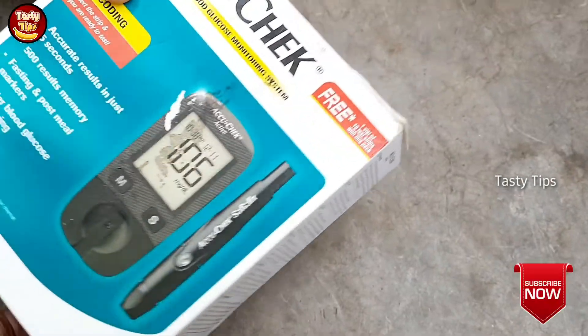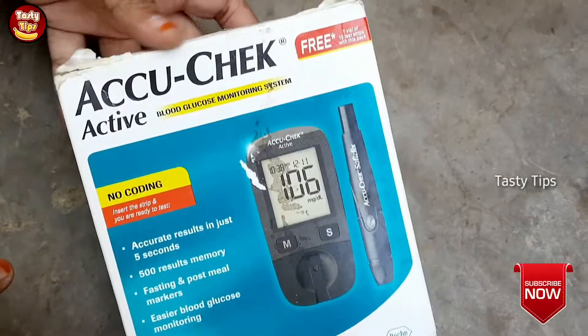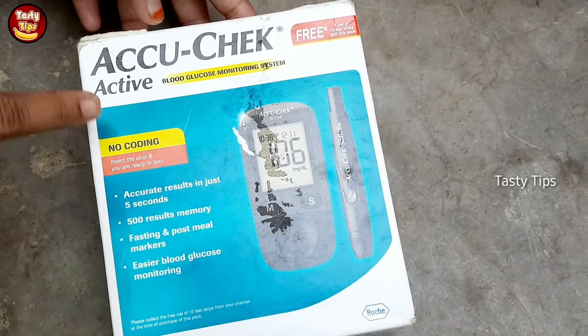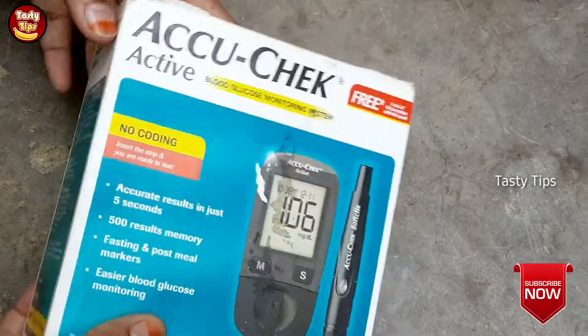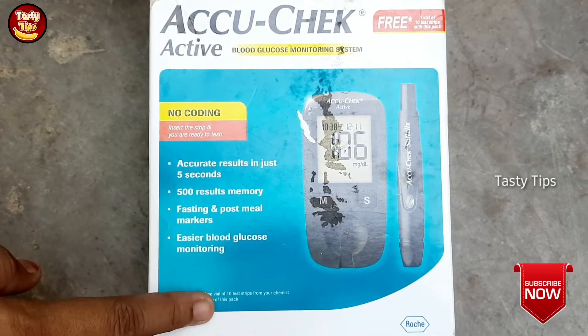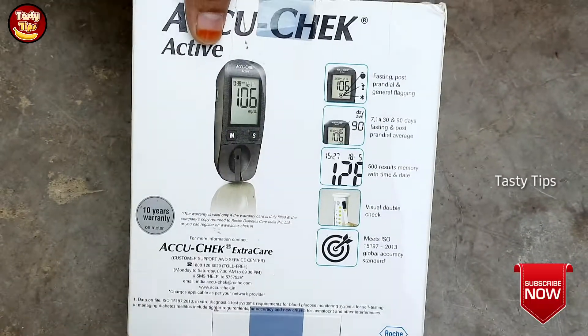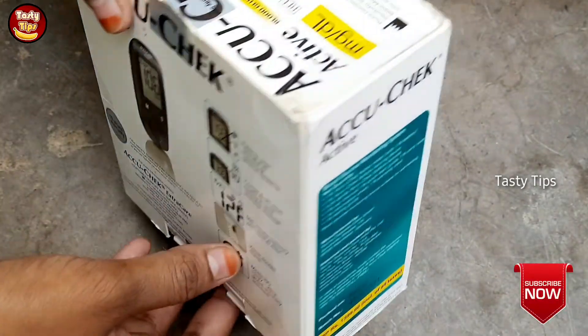But if you don't know anything about it, this is a very useful item. I am going to check the Accu-Check — the blood glucose level. This is very useful equipment. There are a lot of products that are wrong, but this is the most correct product.